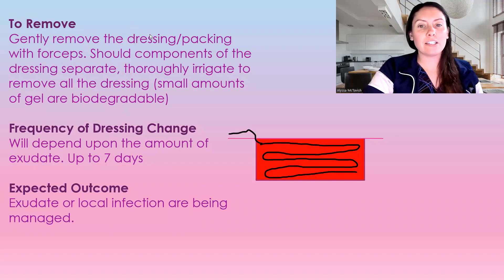To remove this dressing, you're going to gently remove it with forceps. It shouldn't be stuck in there, because we're using alginate dressings for high-exudate wounds, so this is not something that should be stuck. If you notice that it is getting stuck, either it needs to be left in longer — it can be left in for up to seven days — or you need to change to a different dressing. This should not be getting stuck.